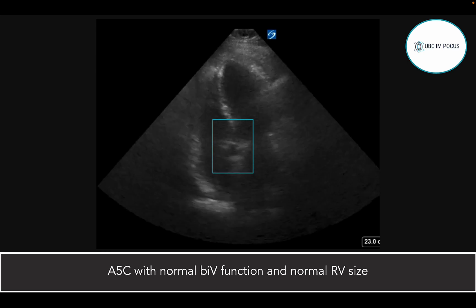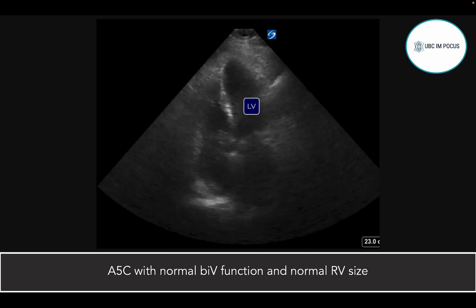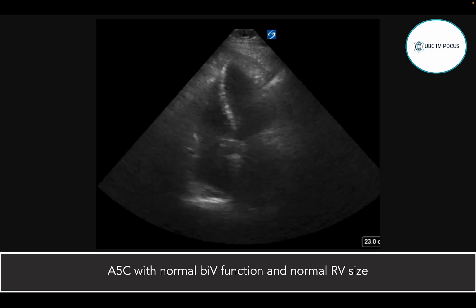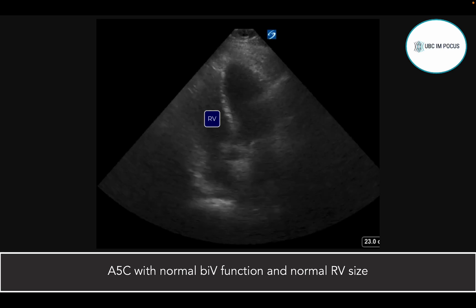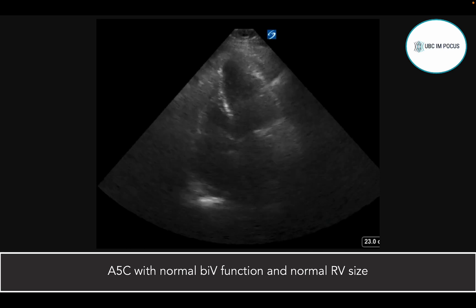And we see the LV, the walls look like they're coming together decently well. We don't see the myocardium super well. So some of this is, with experience, you'll learn what looks normal and what's not normal, even in these suboptimal views. The RV looks pretty normal in terms of size and shape. TAPSE visually looks pretty normal. So this is a fairly normal heart.